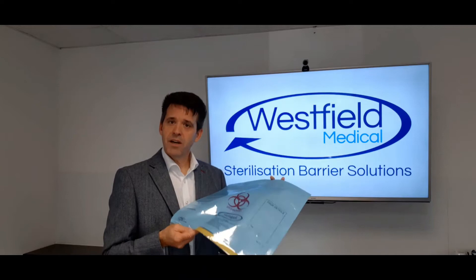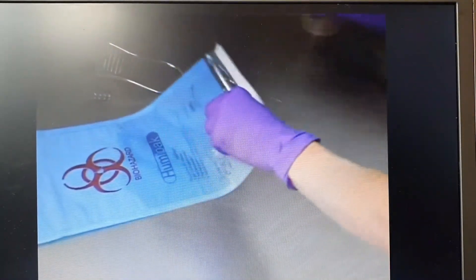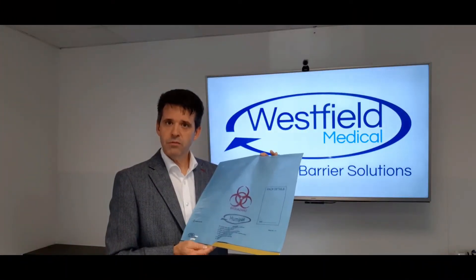The only thing you need to make Humipak work is water. No chemicals to buy, no worries about covering every part of every instrument with sprays, no need to wash away the chemicals before you can clean the instruments properly.